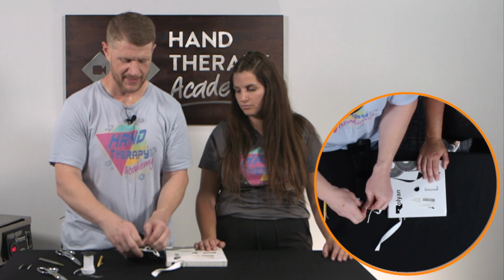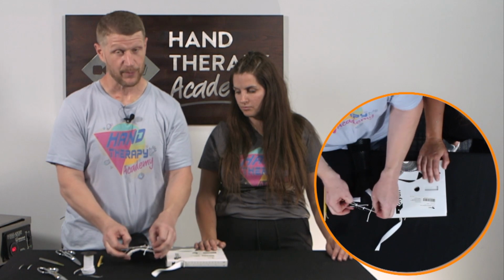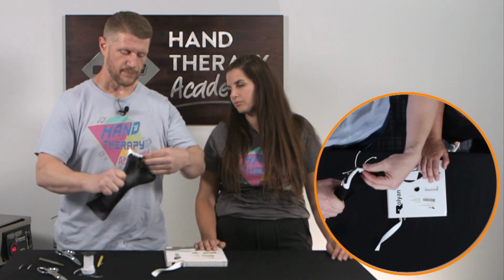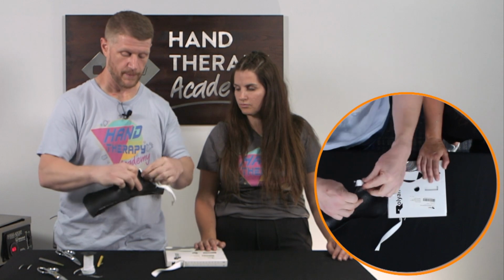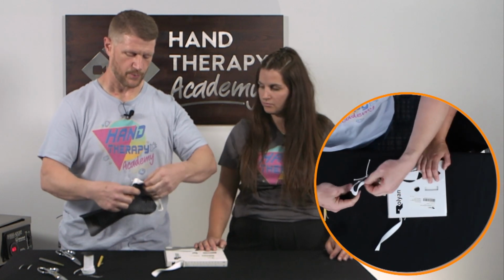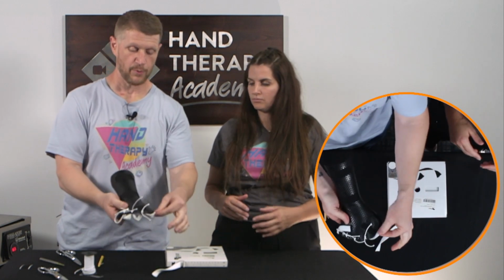We'll test your knot tying skills. You decide what kind of knot you want to do, but basically something secure that's not going to come apart on them because they can't retie these knots on their own. Those little elastic straps will give me the ability to expand those. And I may need to take up some slack off of here, that's why I cut it too long, and create some space for fingers, right? So I'll just work that through and give myself lots of extra room to fit it on them, okay? And then I'll pull that and tighten it.